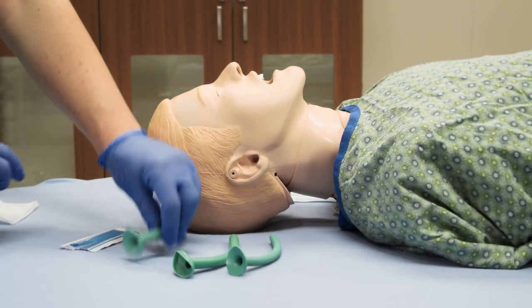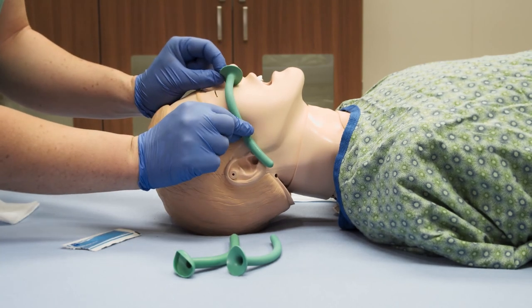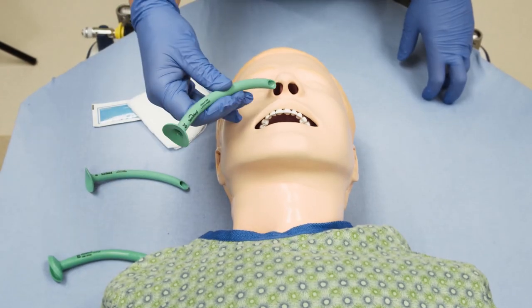Do not use an NPA in people with head and facial trauma. Determine the appropriate size NPA to insert by measuring from the base of the nostrils to the earlobe. The diameter of the NPA needs to be smaller than the person's nasal passage.